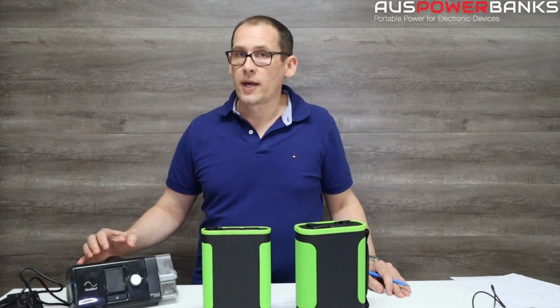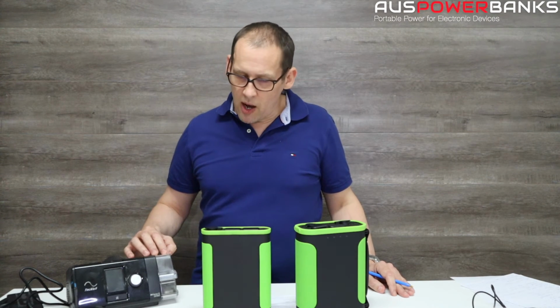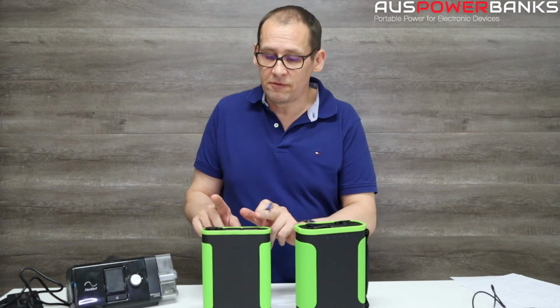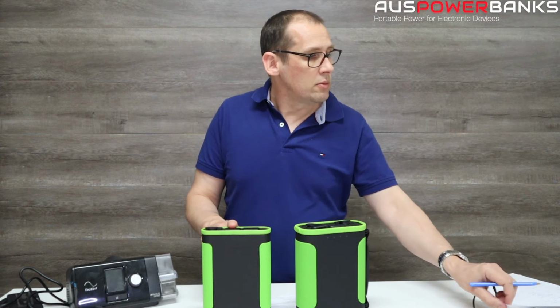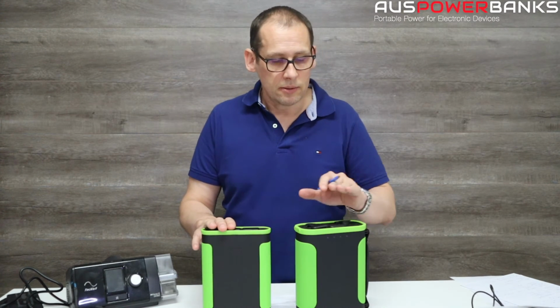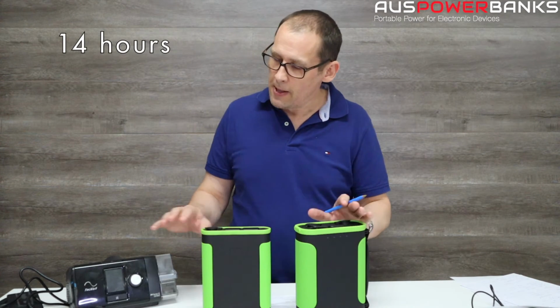So if you were camping, for example, and you wanted to use the humidifier, and based on, say, this 48,000 milliamp power bank that outputs around 150 watt hours, if you're using the humidifier, you're only going to get about 7 hours, max 7 hours. So it's going to just about give you a night. The 96,000, it's going to double that. It's going to give you, say, 14 hours.